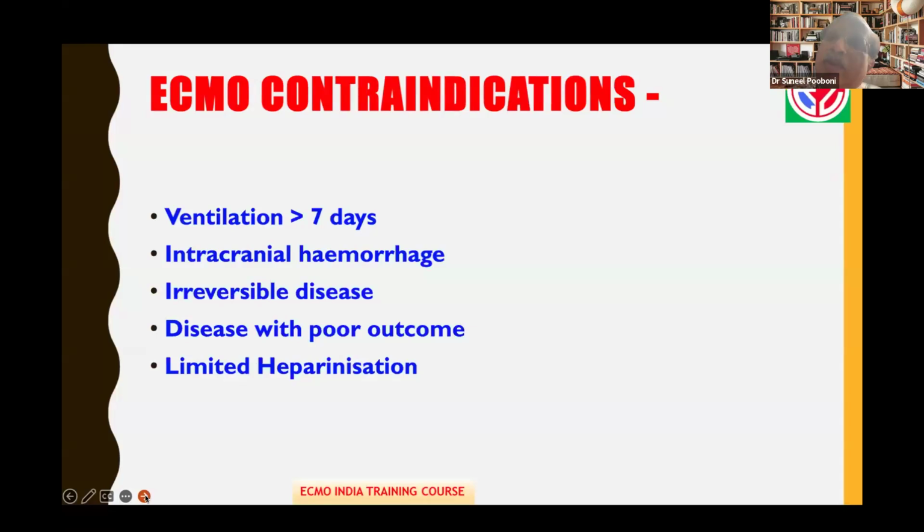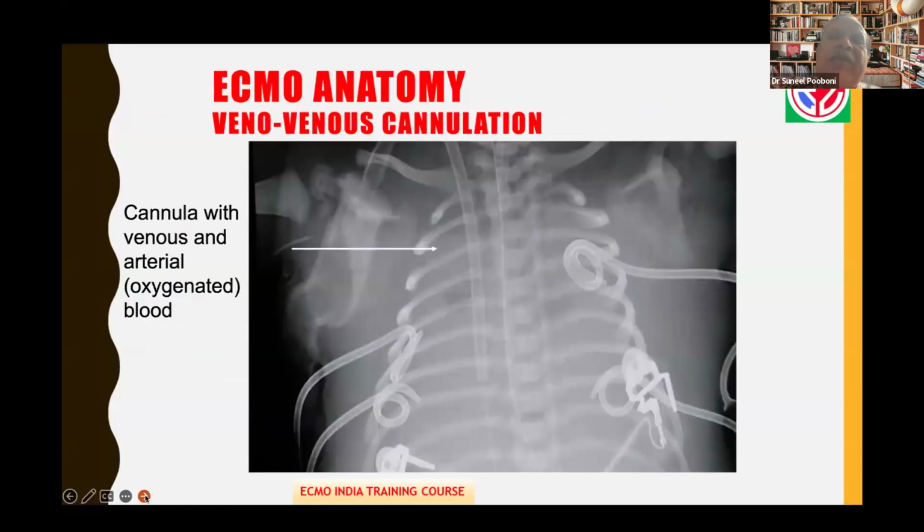ECMO contraindications in any age group are ventilation of more than 7 days, intracranial bleed, irreversible disease, disease with poor outcome, and limited heparinization. Some of the pictures showing you cannulae.